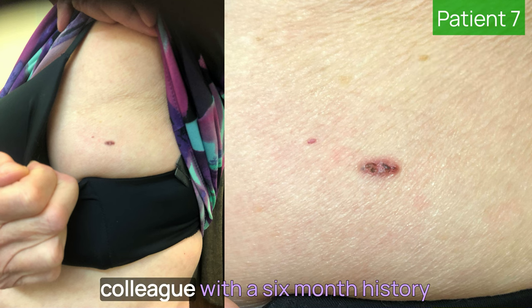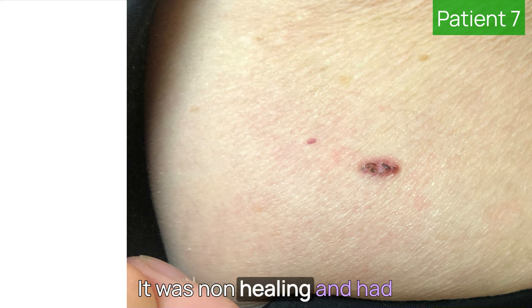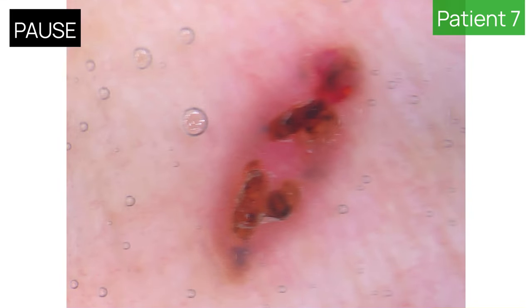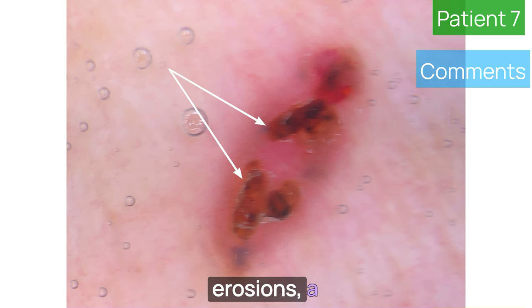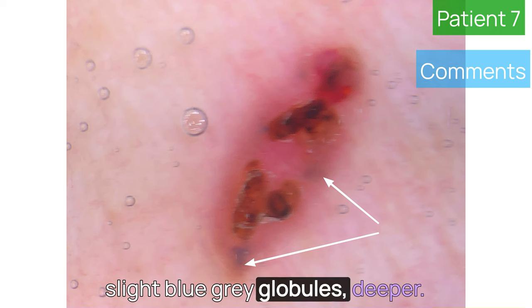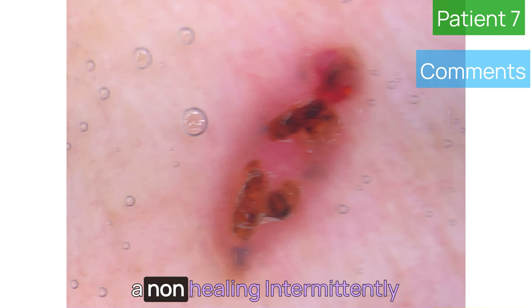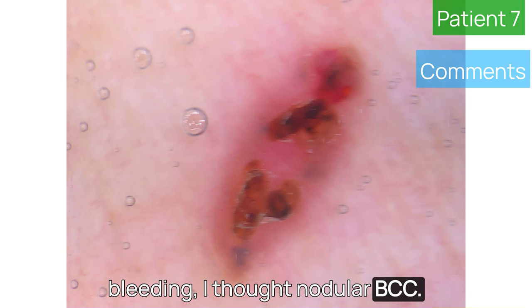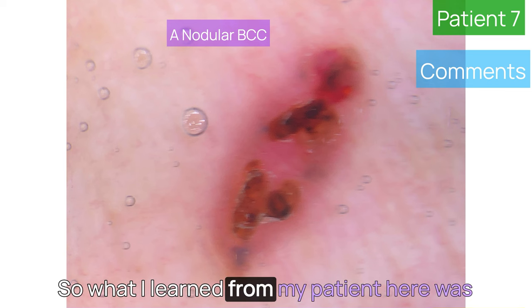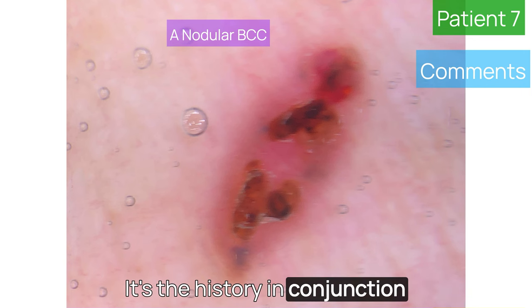This 64-year-old lady came to see a colleague with a six-month history of an intermittently bleeding small nodule below her left axilla — non-healing, no previous skin cancers. All you can really see are a couple of erosions, a homogenous pink background, and slight blue-grey globules deeper. No blood vessels, no shiny white structures, nothing else. However, when I saw this in conjunction with the story of a non-healing, intermittently bleeding nodule, I thought nodular BCC. This was the first BCC I ever removed, and it proved to be a nodular BCC. What I learned from this patient: it's the constellation of features — history in conjunction with the signs — that gives you the diagnosis.